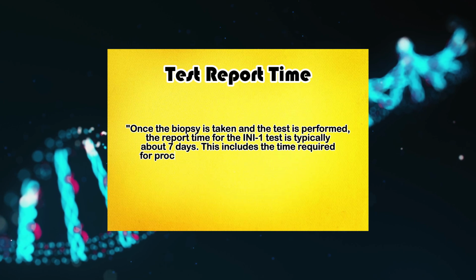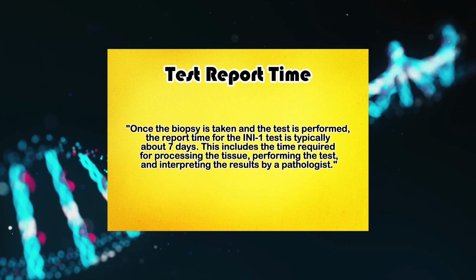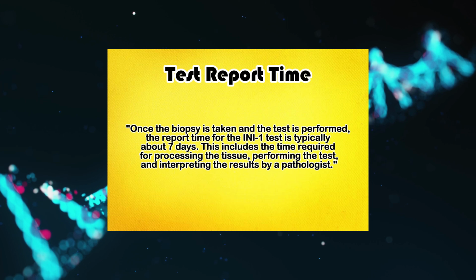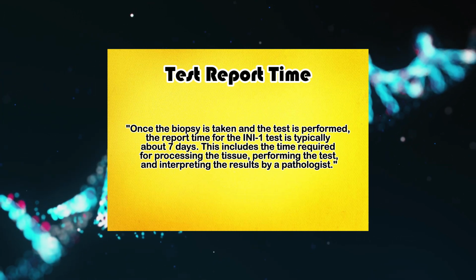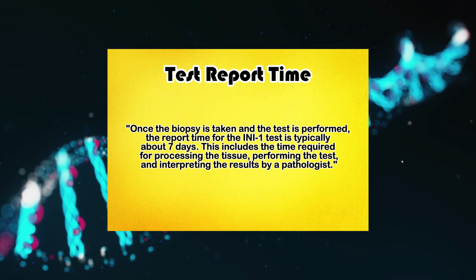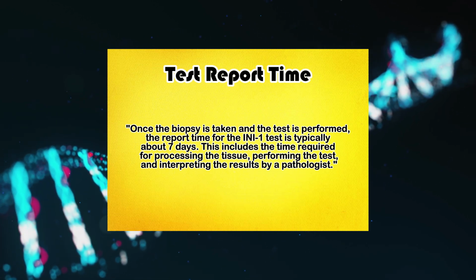Test report time. Once the biopsy is taken and the test is performed, the report time for the INI-1 test is typically about 7 days. This includes the time required for processing the tissue, performing the test, and interpreting the results by a pathologist.